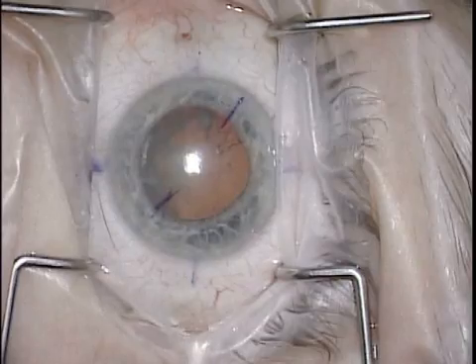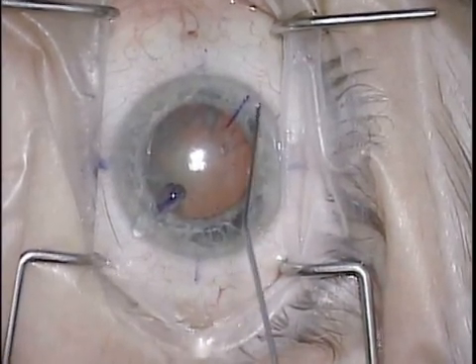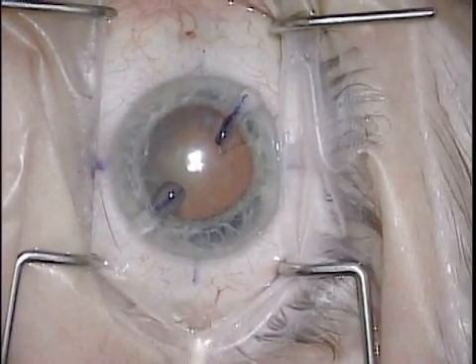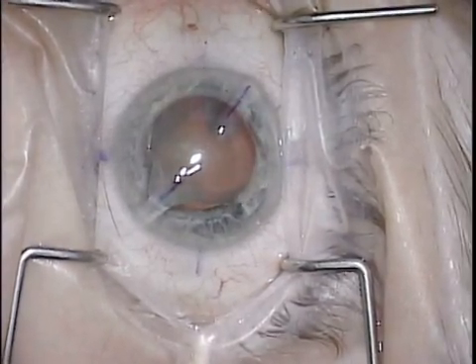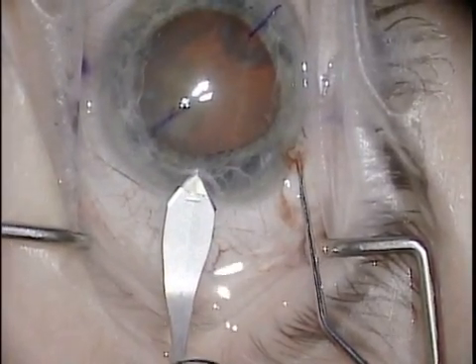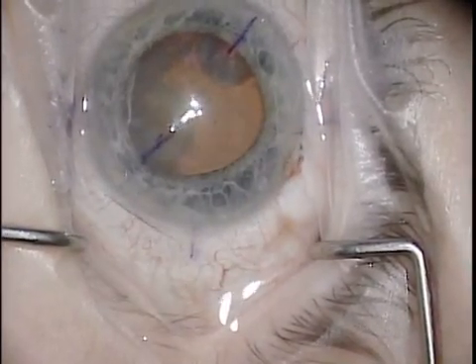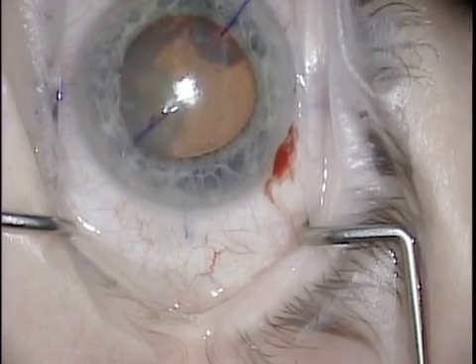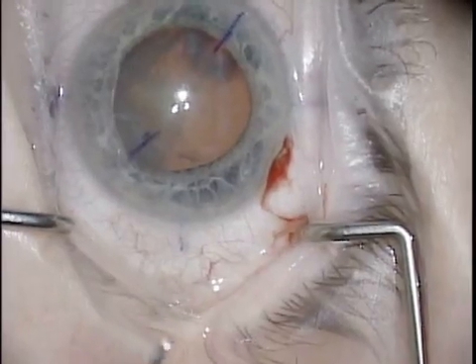Note that during the entire marking sequence, the corneal surface remains visible. A little viscoat applied to the marks will aid in their retention during phacoemulsification. The incision is made temporally and the cataract removed with the surgeon's standard technique. Note that the incision was placed exactly on the marked horizontal axis to comply with the computer calculation of the optimum axis for the lens implant.